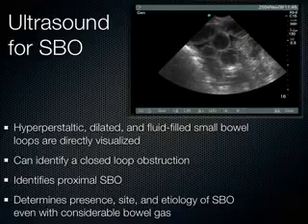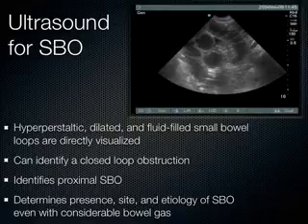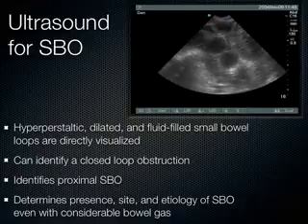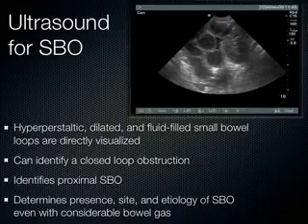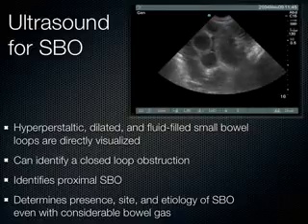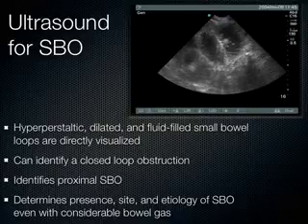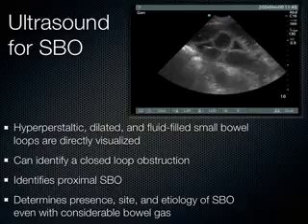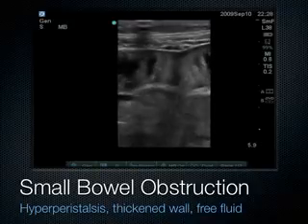And this is where it can excel over chest abdominal x-rays, in the fact that you could have a very proximal small bowel obstruction where the x-ray doesn't see it because the patient's been vomiting so much there's no longer an air fluid level, and therefore the x-ray could miss it. Well, ultrasound can pick those up. And also there's something called a closed loop obstruction. You know what that is? A closed loop obstruction is where you have small bowel that's been twisted on both ends, and there's a section in between, a closed loop, where there's no air. It's just a small bowel obstruction without air in it. And without the air, you don't get the air fluid levels you see on an x-ray. And so that's how x-rays miss these, which we see quite easily on ultrasound. And so this is just another example here of the small bowel, the plicae circularis going all the way across.